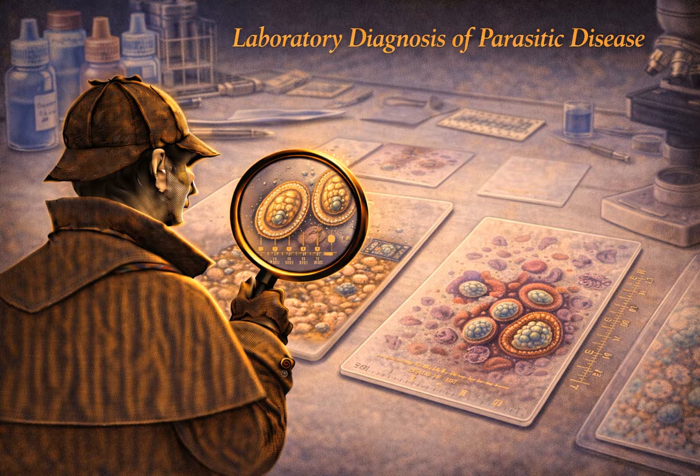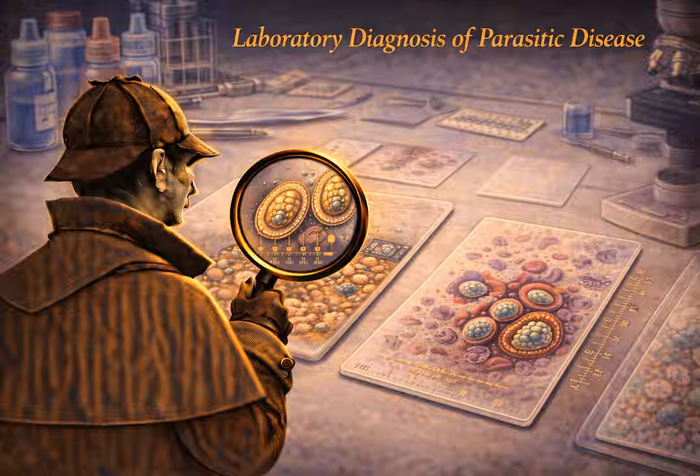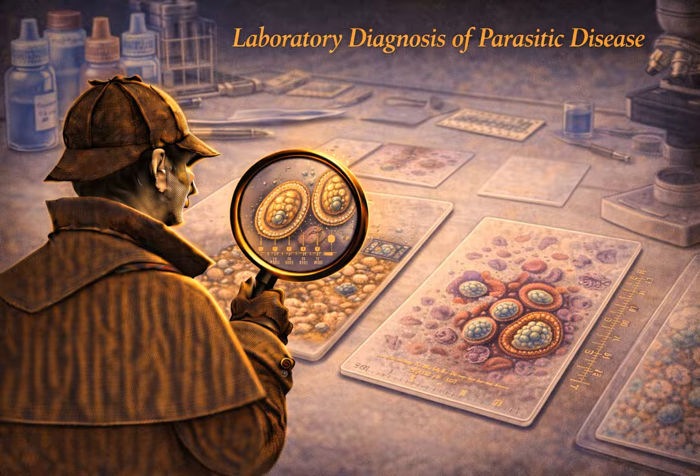And xenodiagnosis, I feel like this is a bizarre historical curiosity, but Murray explicitly includes it in the text. It is totally fascinating from a biological perspective. It was historically used primarily for diagnosing Chagas disease, caused by Trypanosoma cruzi down in South America. In the chronic late phase of Chagas disease, the patient develops severe heart failure, but the actual parasites circulating in the peripheral blood are so incredibly scarce that you will almost never see them on a standard stain slide. So if you can't see them, and PCR didn't exist yet, how do they find them?